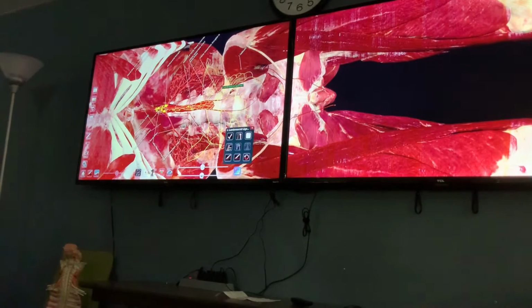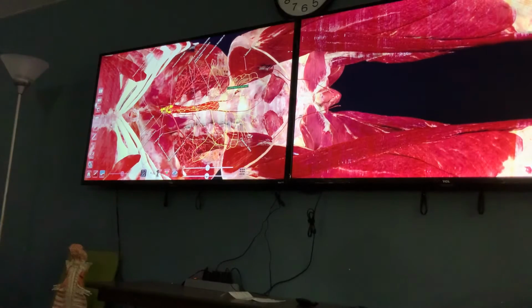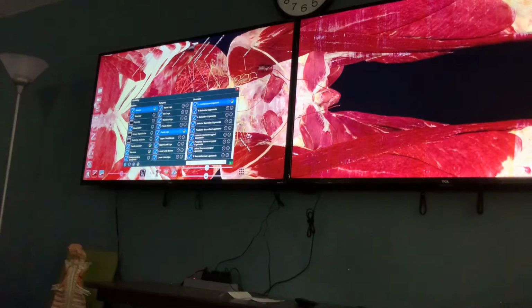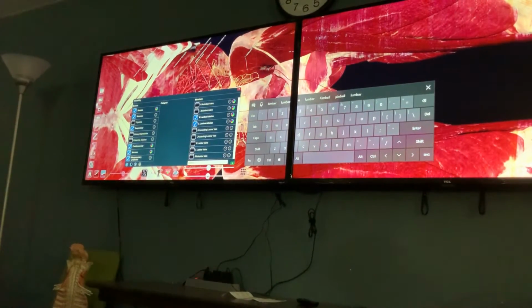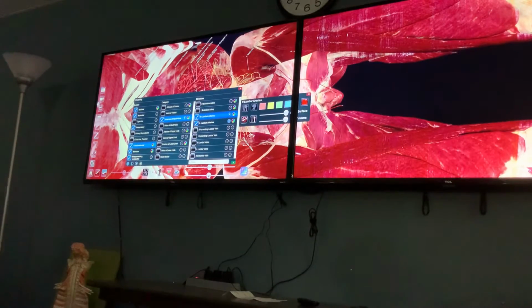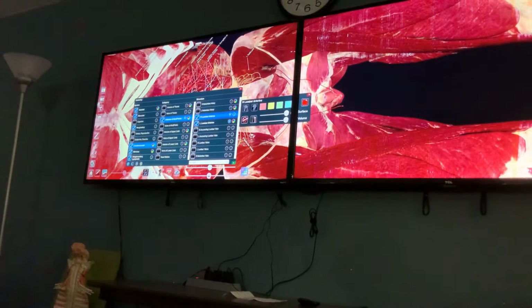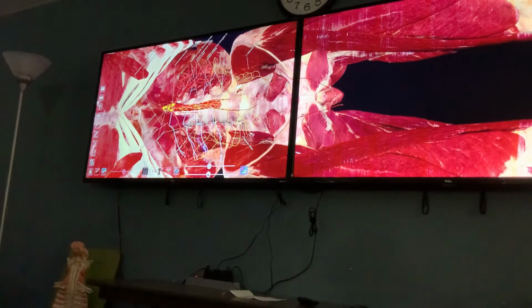Let's try that tag in a blue color. Okay, so we can see highlighted there all of those lumbar arteries.